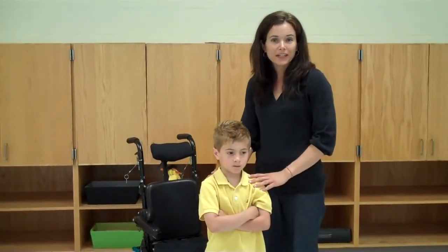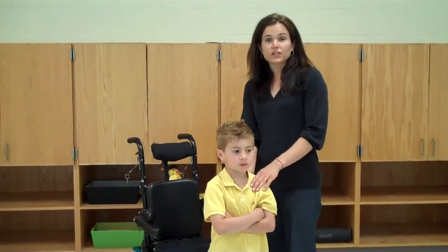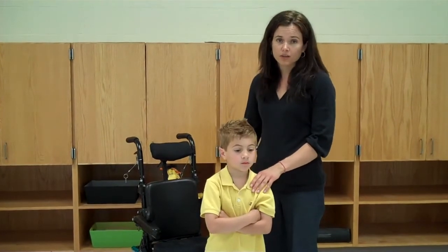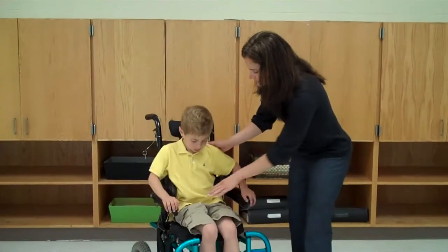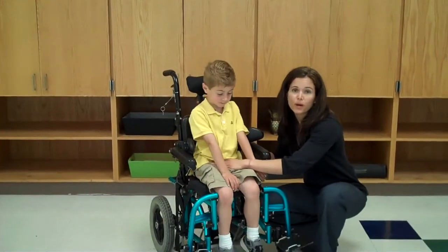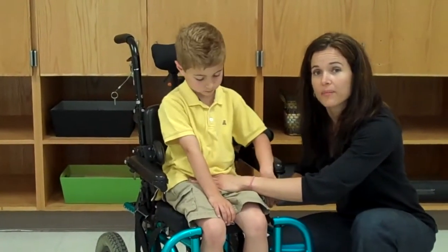Okay, let's get Quinn in this wheelchair. Before he transfers in, we always make sure that the wheel locks are properly secured. We're going to help him get in the seat. And before we do anything, we want to make sure that his pelvic positioning strap is secured.